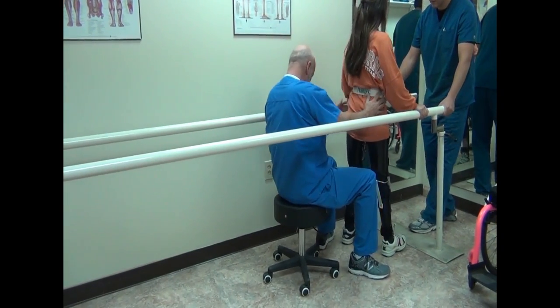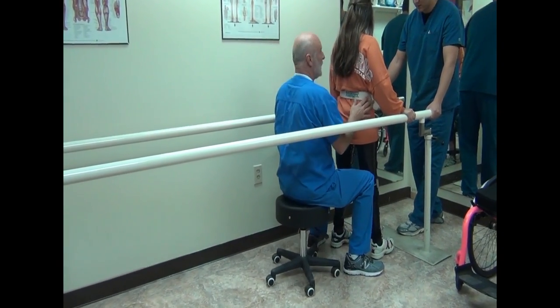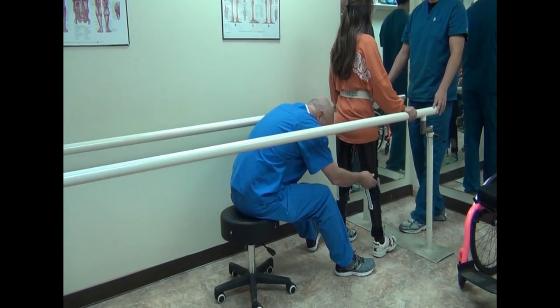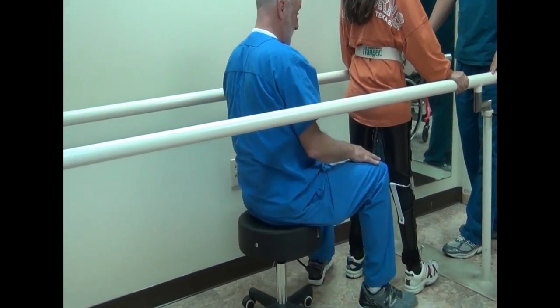How does everything feel so far? Good — nothing uncomfortable? No. Okay. The fit looks very good. I don't see any issues with the fit.